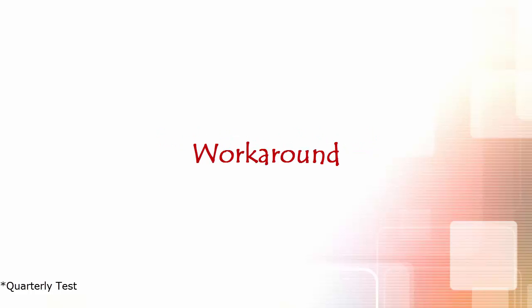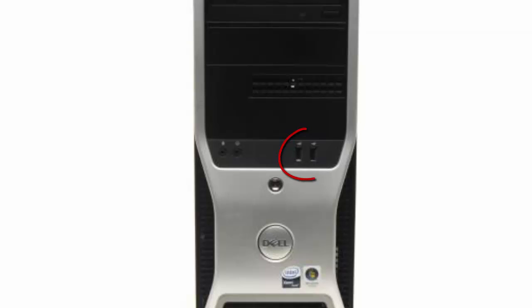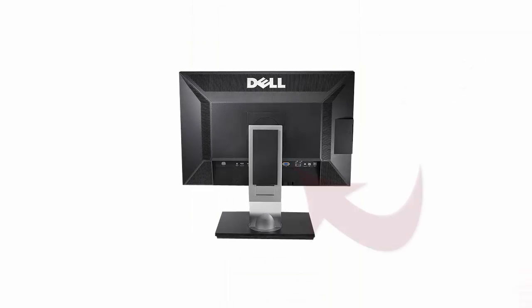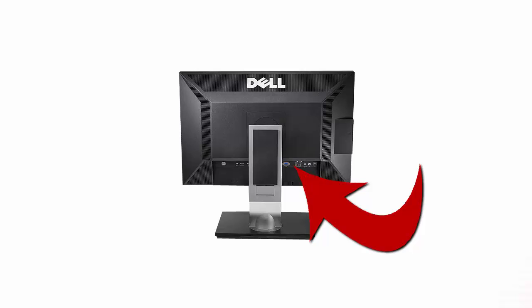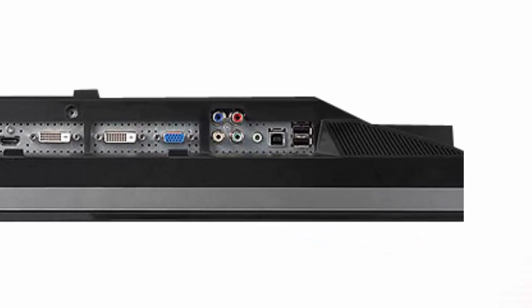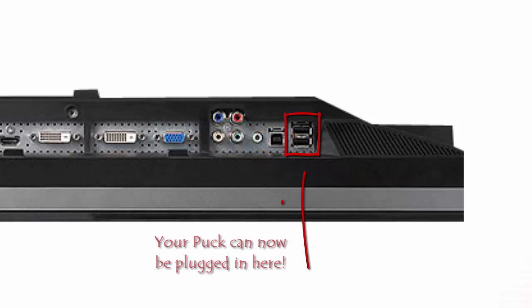If your puck is not able to reach, locate the USB cable shown here. This cable was packed with your monitors when you received them from VRAD. One end of this cable plugs into the computer, while the other plugs directly into the back of your monitor. This process will enable your monitor to become a USB bus, which allows you to plug USB devices into it. At this point, you can plug your puck into any open USB port on this monitor.